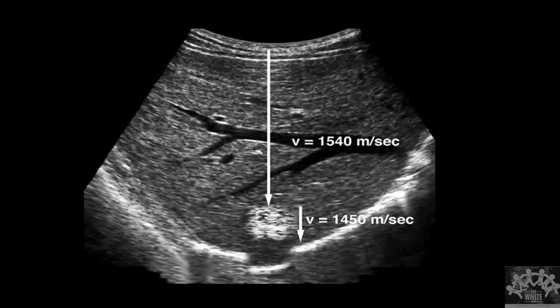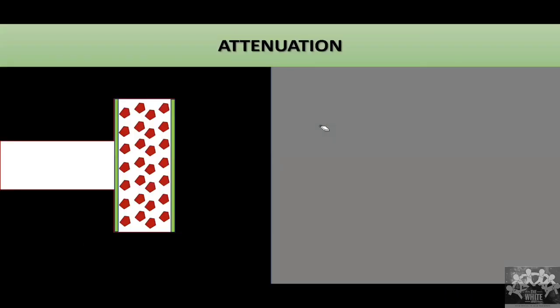So what will help us differentiate? The flow inside will help us differentiate. The bile duct has very, very slow movement of the bile, whereas the vein has slightly higher, detectable flow, whereas the artery has very high flow. So Doppler will help us identify what this structure exactly is. As of now, you need to know that this can be an artery, a vein, or a bile duct. These are the three things. If you are regularly seeing ultrasound, you will be able to identify; otherwise, you will not.